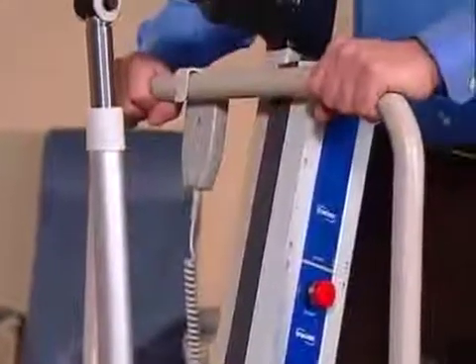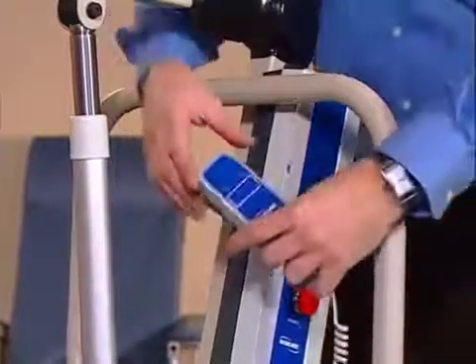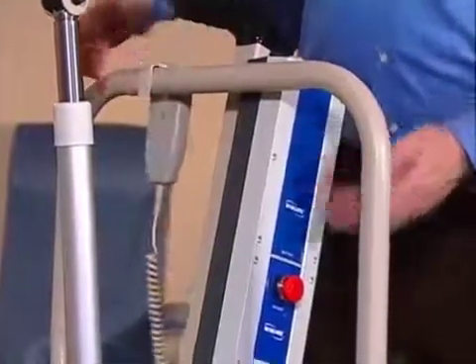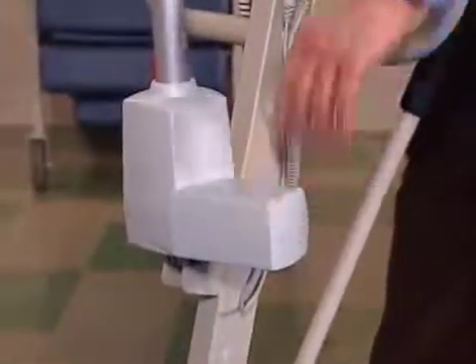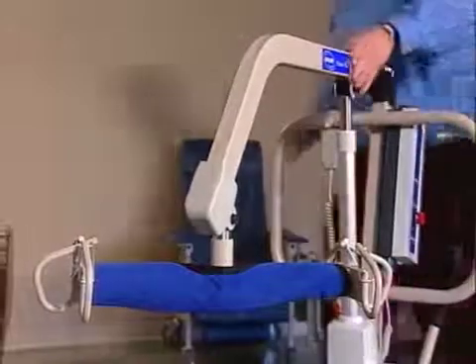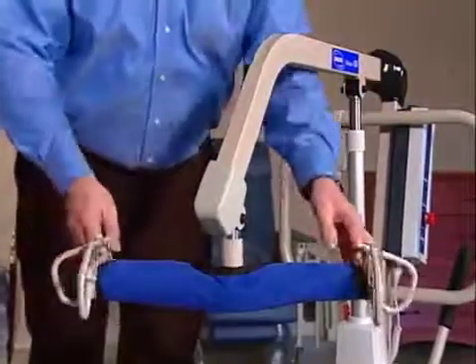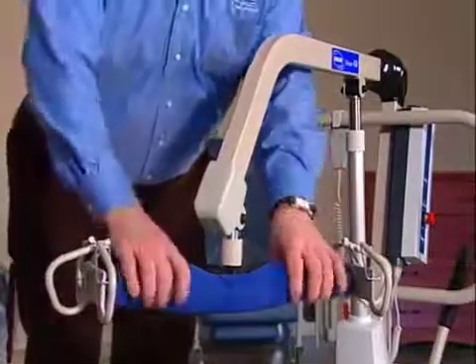The next assembly is the mast. Here you'll find these ergonomically designed push handles, a hand pendant which houses the operator's controls, the battery, a control box, and the actuator which actually lifts the patient. Attached to the mast is the boom. The boom is the lifting arm, and at the end of it is the swivel bar. The sling attaches to the swivel bar and it's padded for safety.